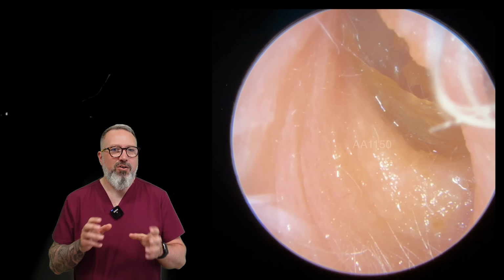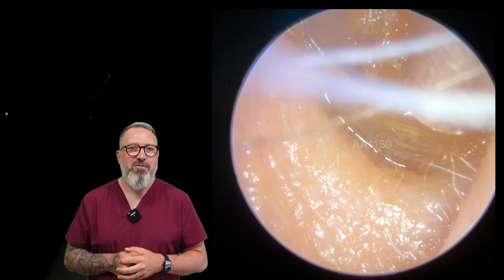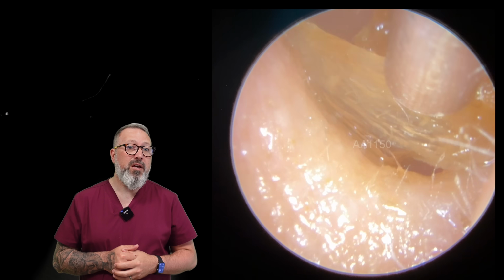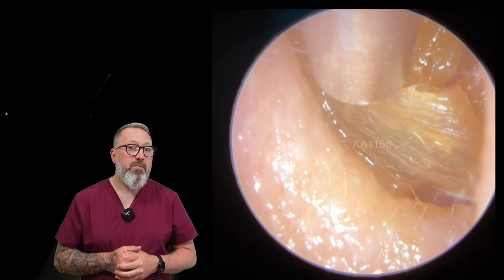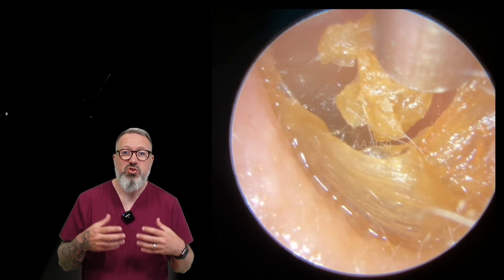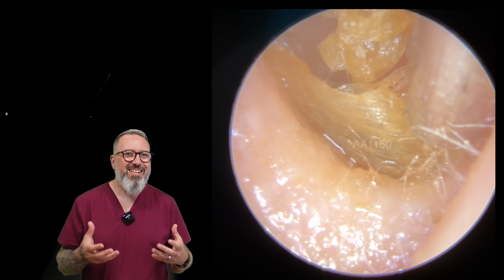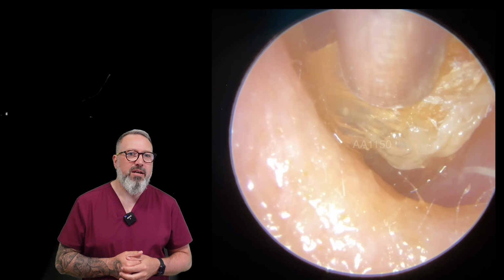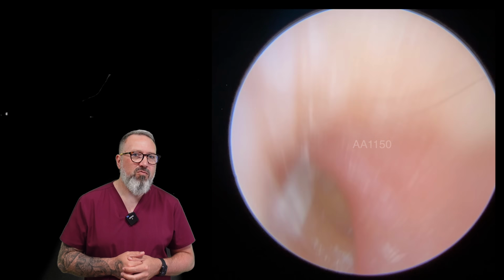And sometimes I really hope we're going to get a little bit of a skin ribbon with this one. But you can see that, a bit similar to Taylor's, that little ridge at the bottom there. So this skin's actually a little bit harder. Background to this patient, they like to do a lot of swimming. With the chlorine, it does tend to dry the skin a little bit. And that's what's happening here in the ear canals on both sides. But you can see that really thick layer.